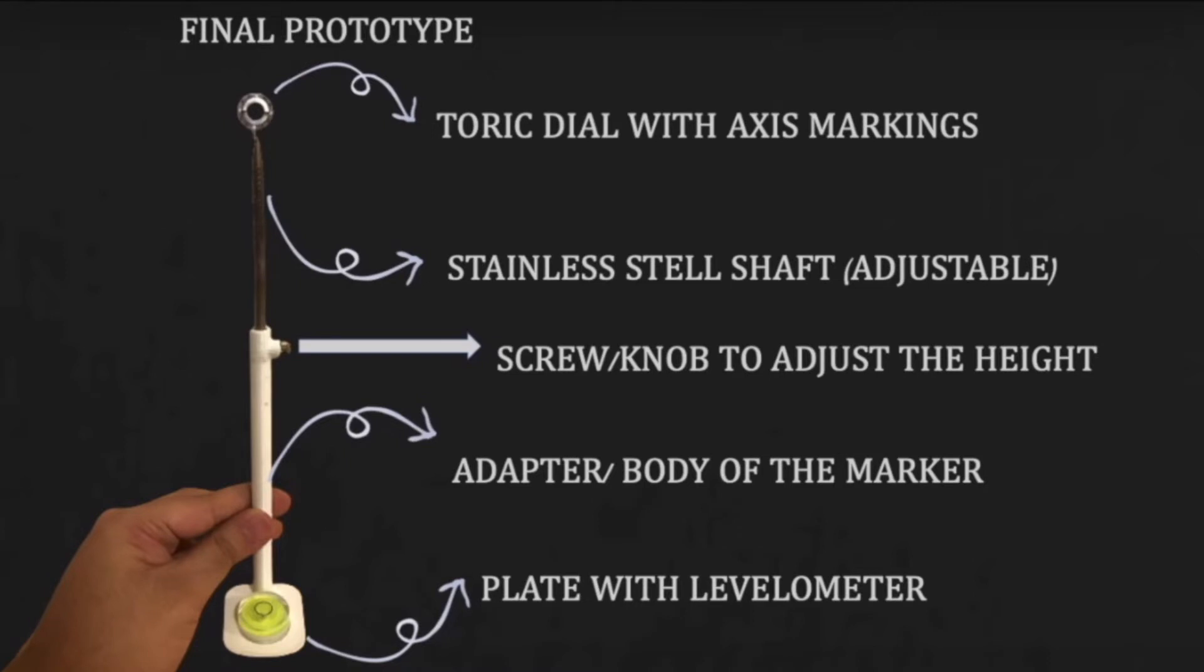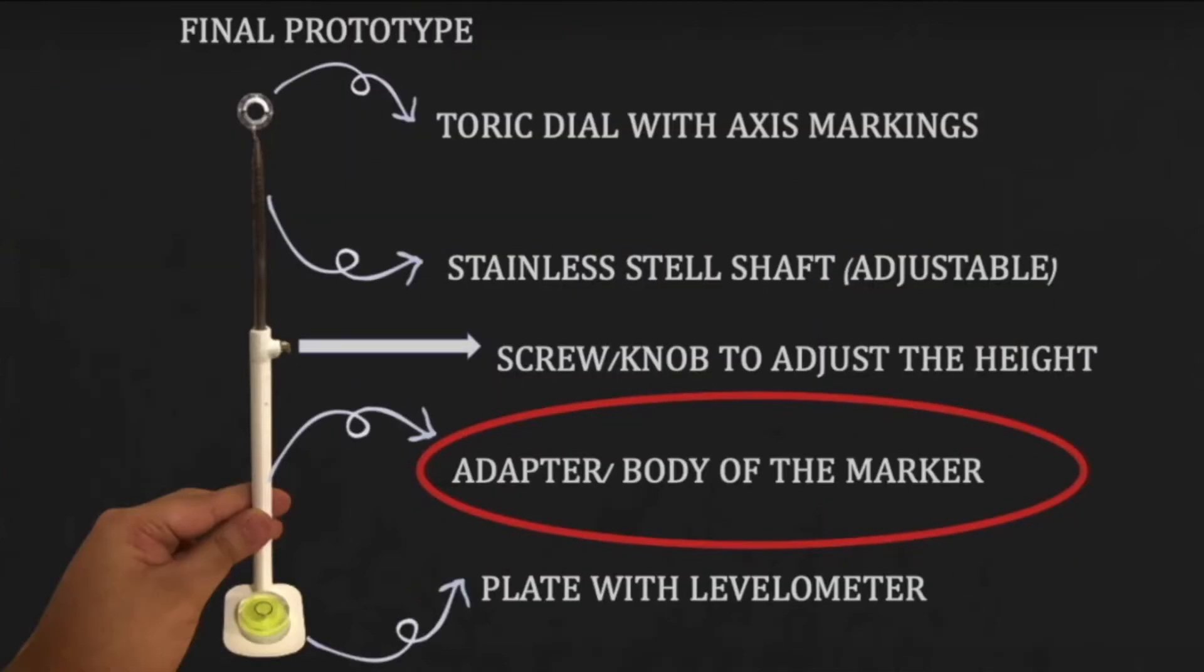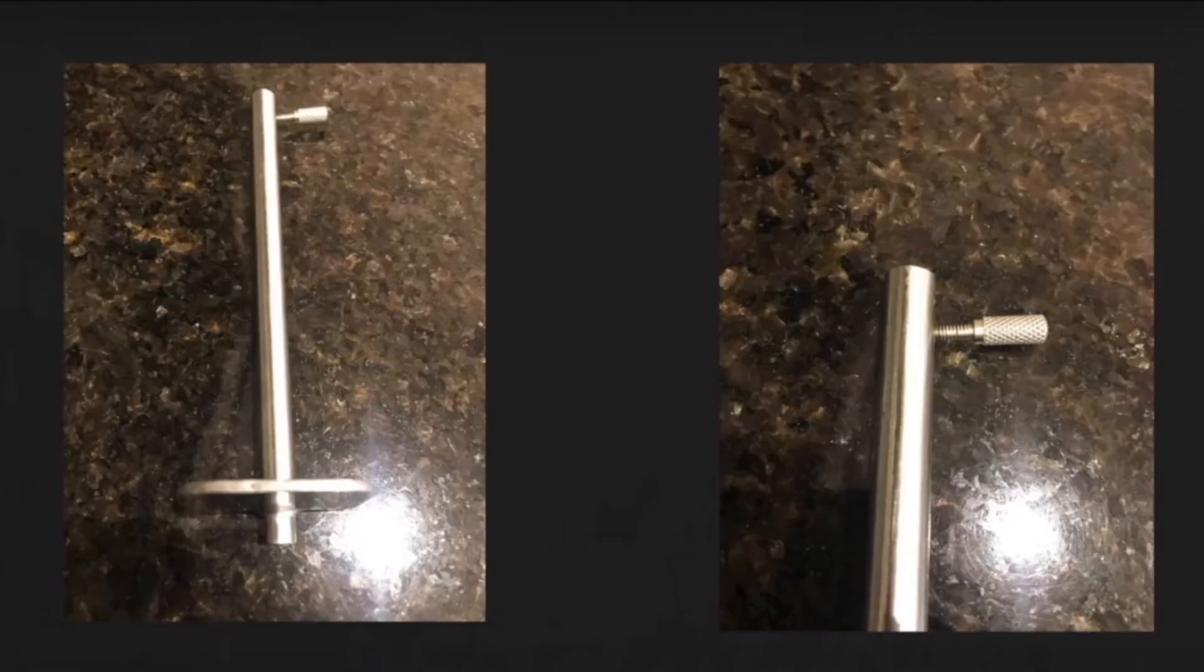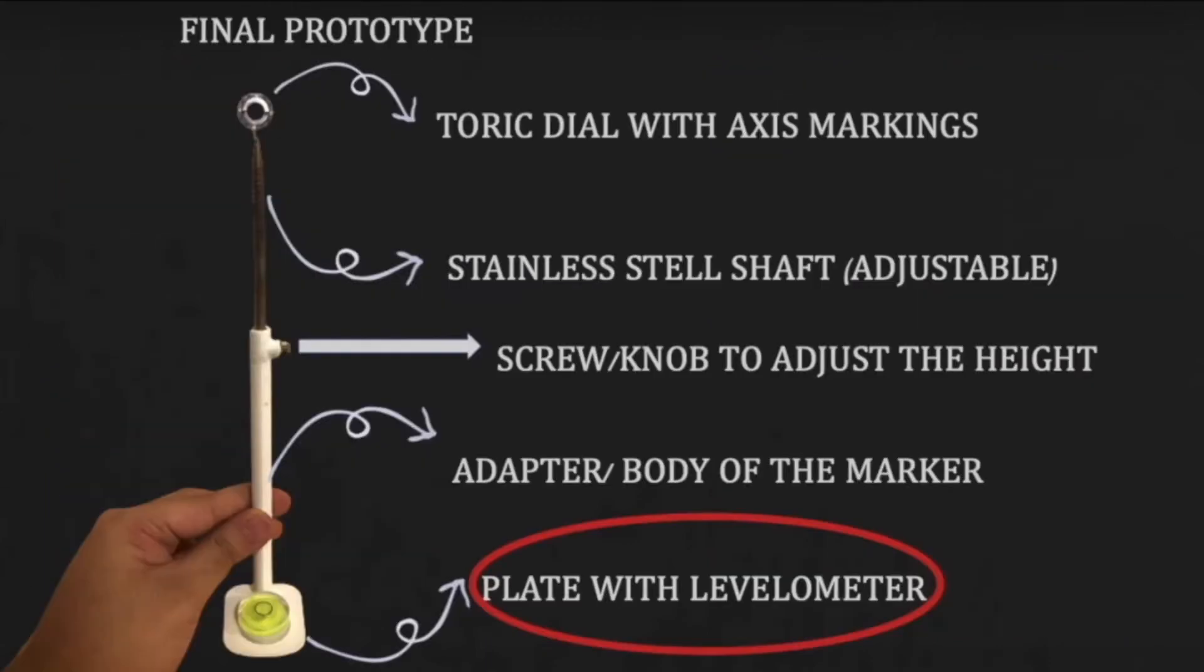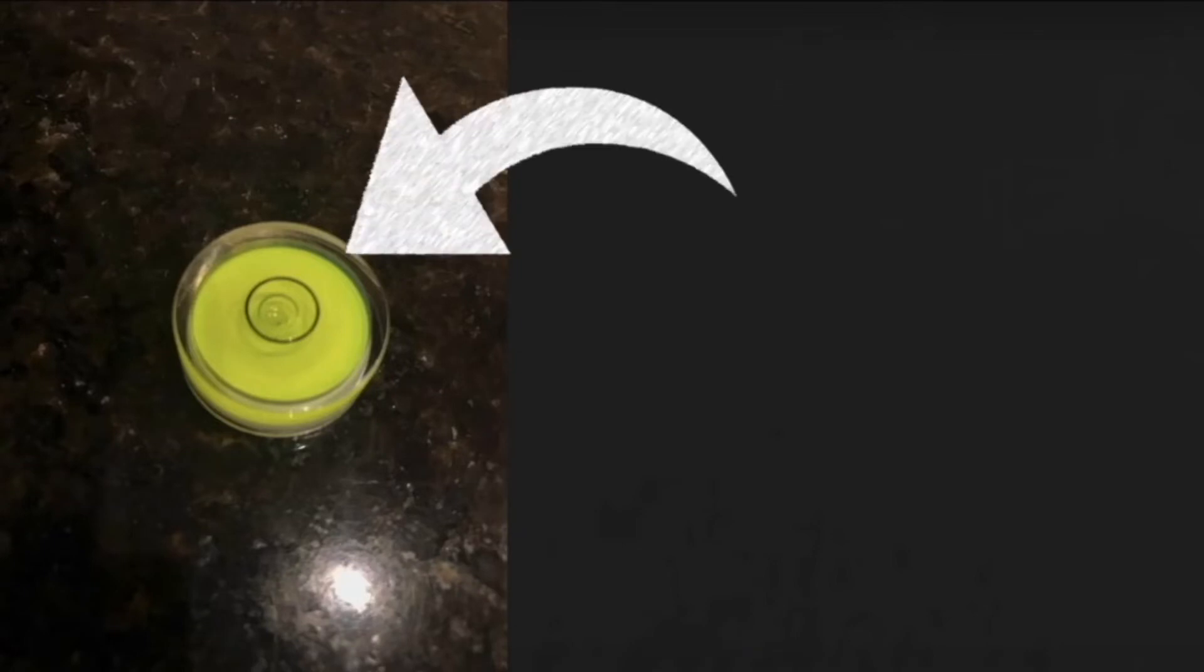Now the final prototype consists of a dial with a shaft made out of stainless steel. The dial is rotatable 360 degrees and has an atraumatic edge. On the other hand, the adapter or the body of the toric marker is along with a plate to accommodate a levelometer called the bullseye levelometer. This bullseye levelometer makes sure that the toric marker is perpendicular to the table of the slit lamp.